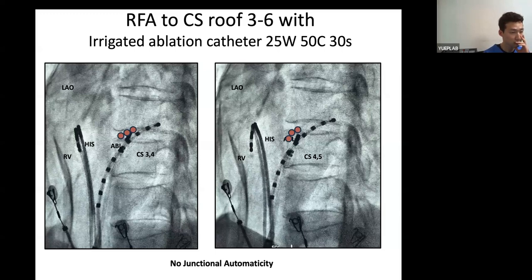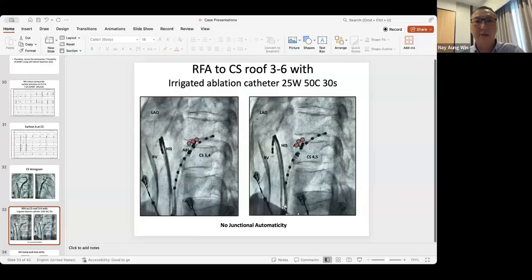Okay? Yeah. So I think this patient has some anatomical variation. It is difficult to look at the EGM, but I think with a single slow pathway, you could ablate from a little bit more proximal. Then you'd have a junctional rhythm and a beautiful tracing. That's the reason you did not have any junctional rhythm during the tachycardia ablation. Okay? Yeah. That's what I can tell you. All right? Good job. Thanks for the wonderful case. Okay. Anybody has any comment, please ask a question.